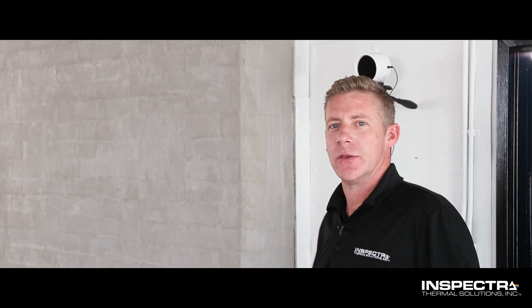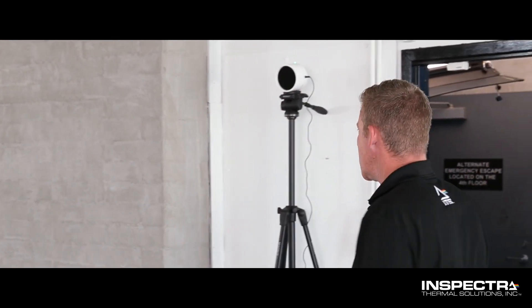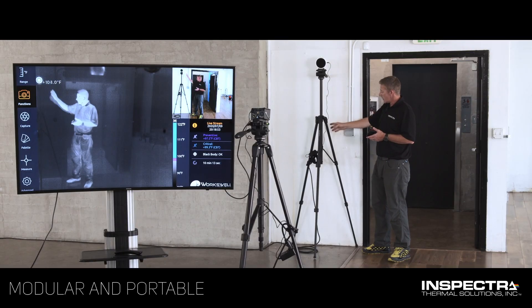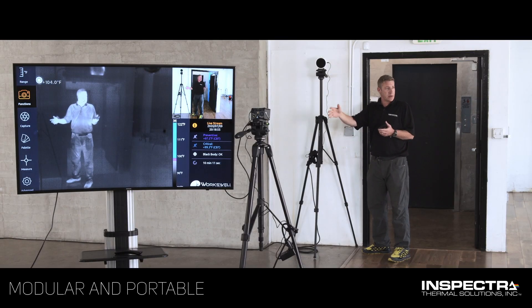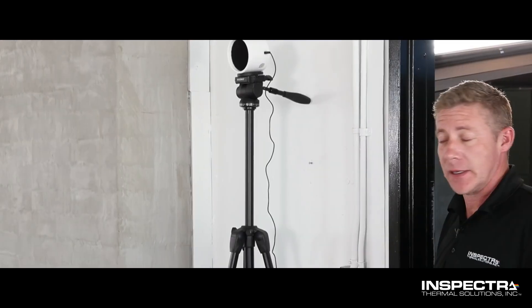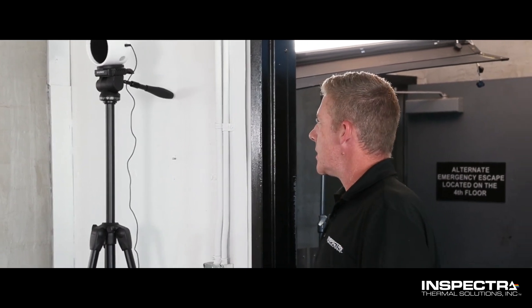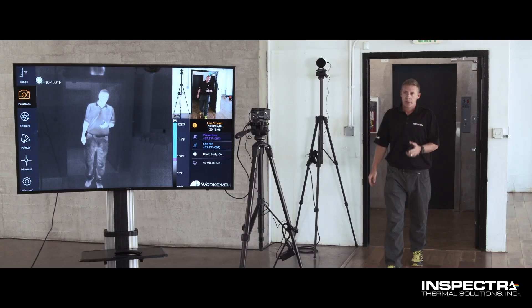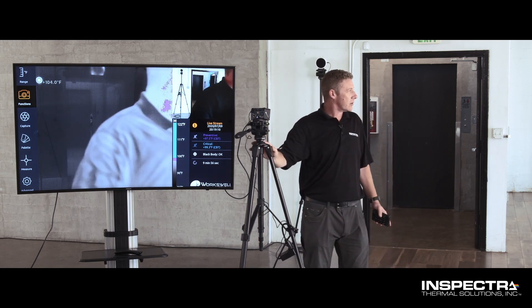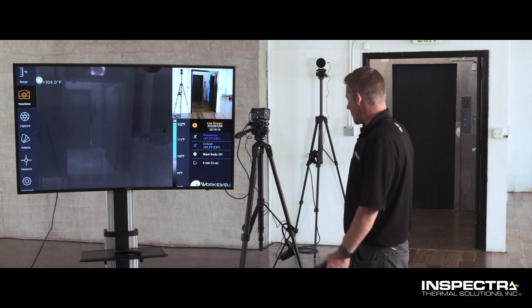I'd like to finish showing you the setup for the elevated body temperature scanner, the Metacast system. We've got the temperature control module mounted on the tripod, so it is modular if I need to move it around, but at this point it's set. I'd like to record the temperatures of the actors and cast coming in here at Apex Studios. Come over here and see the camera system set up on a tripod as well. We've got everything locked down and secured, with all the cables out of the way.